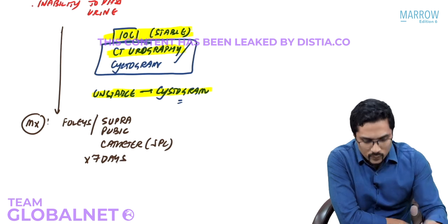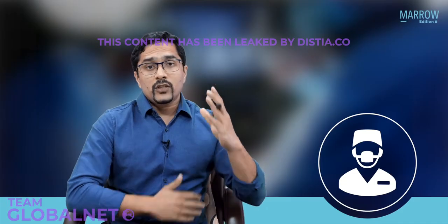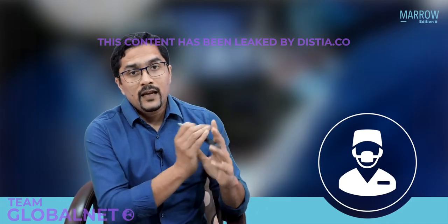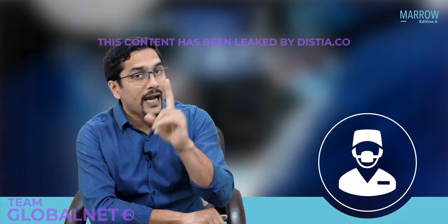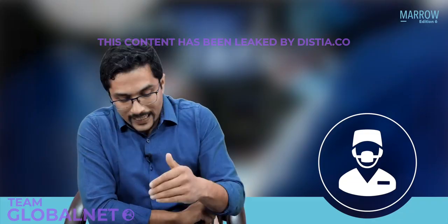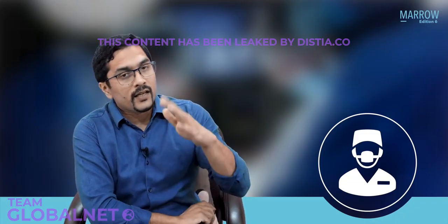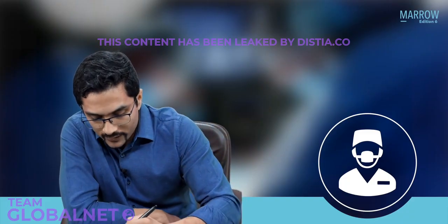So when do I put a Foley's and when do I put an SPC? If there is a suspected associated urethral injury, as I've already told you in urethral injury, I won't put in a Foley's. I'll then put in an SPC. If there is no associated urethral injury, then I can put in a Foley's for 7 days.